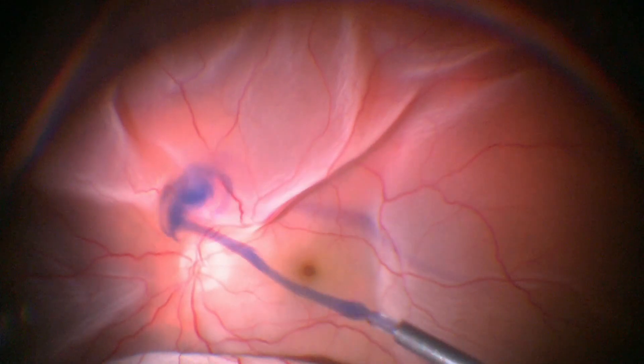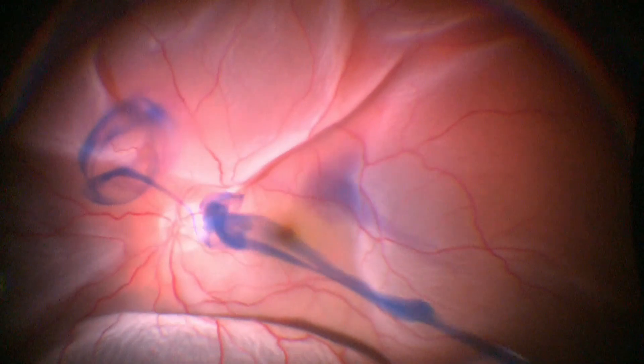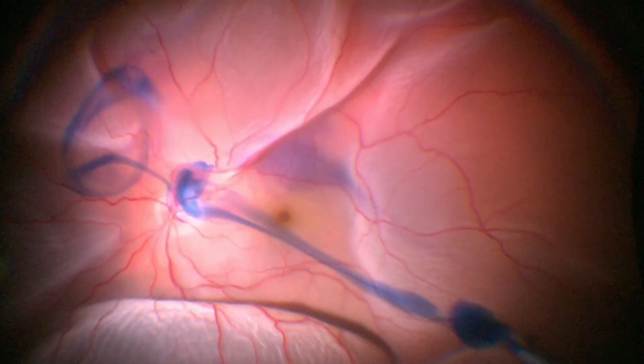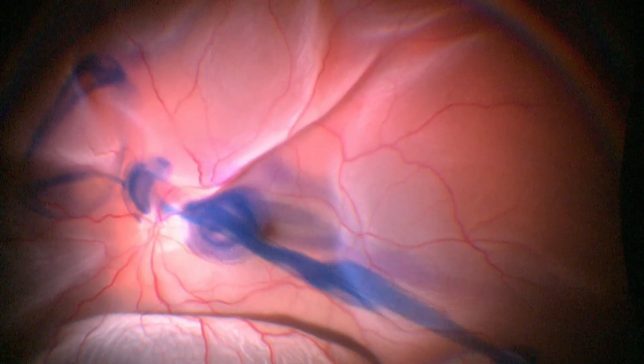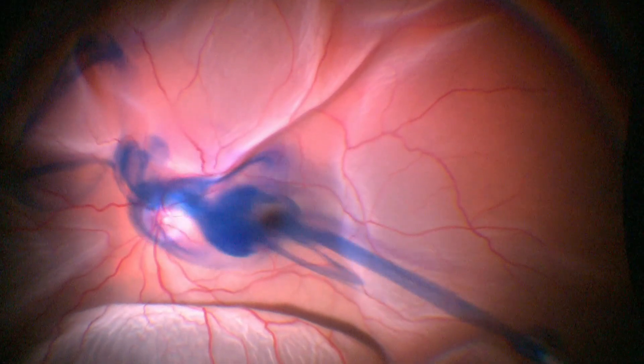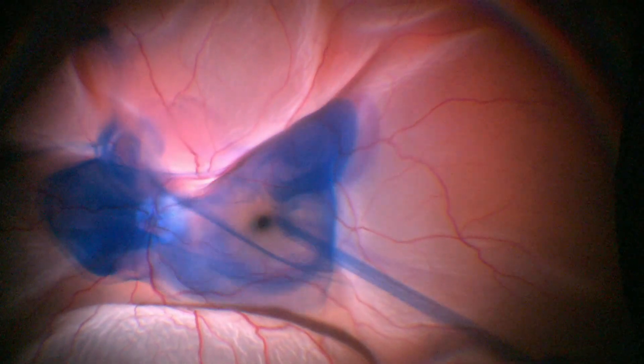To summarize, retinal detachment with macular hole have variable presentations, and in this video we have shared some of the techniques that we use for such cases.